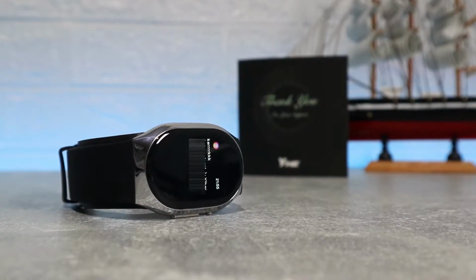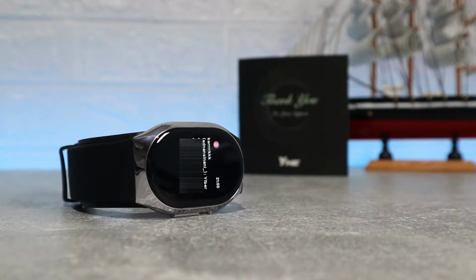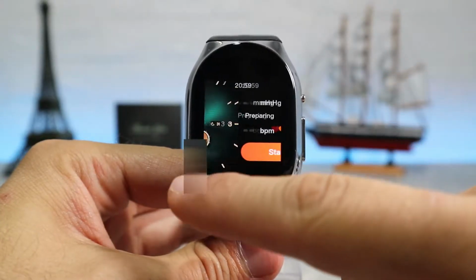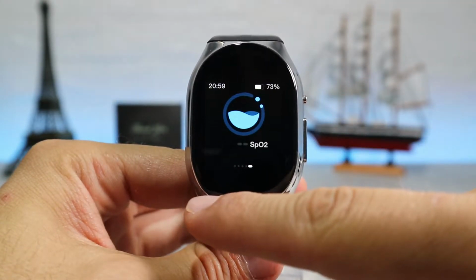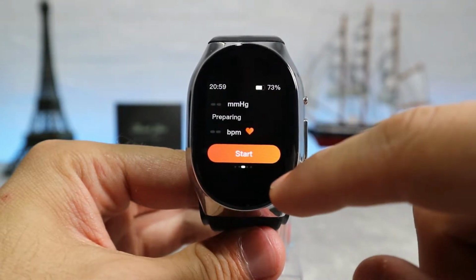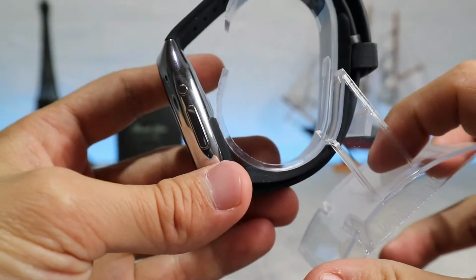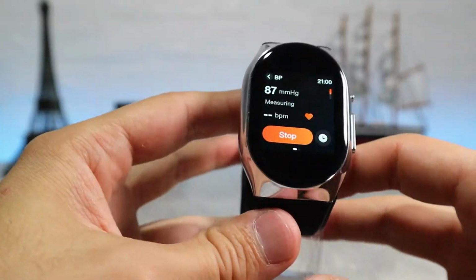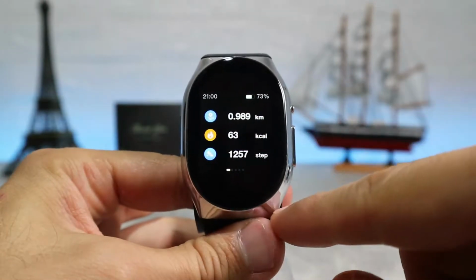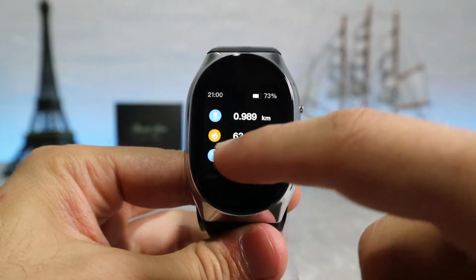If you swipe up, you have the notifications which you receive on your phone, and you can also open and read those. If you swipe right, you can see some of the widgets we have set up, like blood pressure, heart rate, and SpO2 monitoring the oxygen in our blood, where you can monitor and see your statistics on your blood pressure, heart rate, and also measure it if you want. When you swipe left you can see all your activity as steps, calories burnt, and distance.